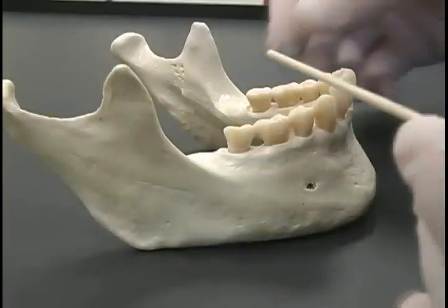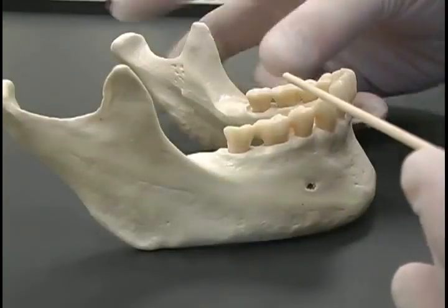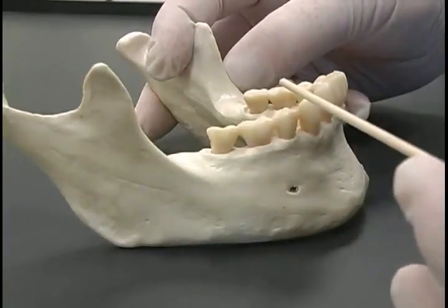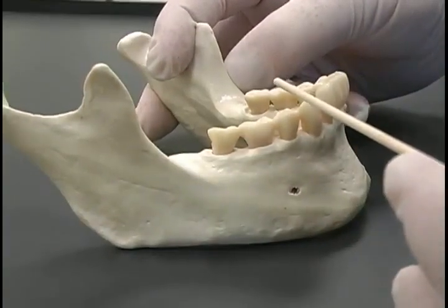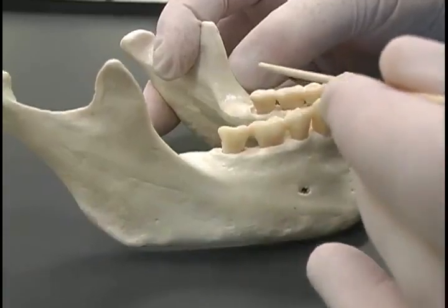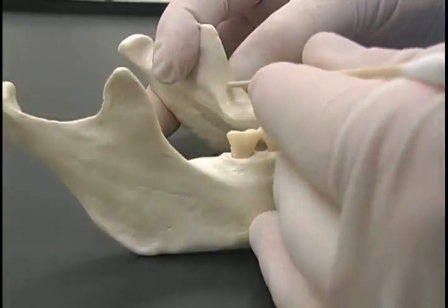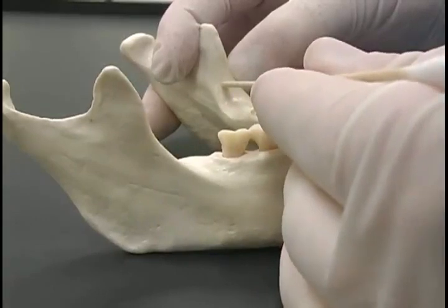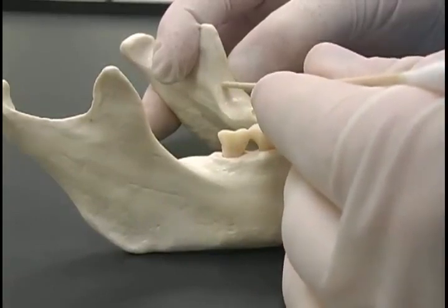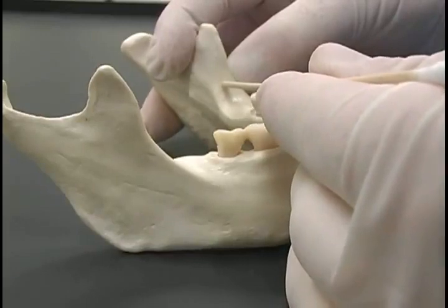When using the external oblique ridge as a landmark, place a finger with the nail exactly at the external oblique ridge like this, then aim for about 5 millimeters medial to this anatomical landmark, going 1 centimeter above the occlusal plane on the average patient.